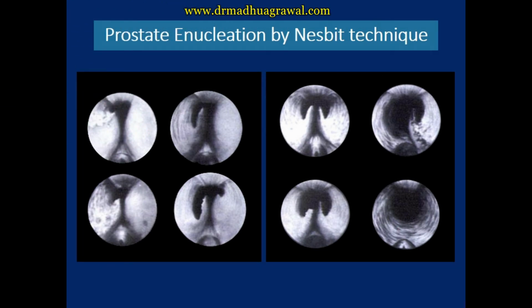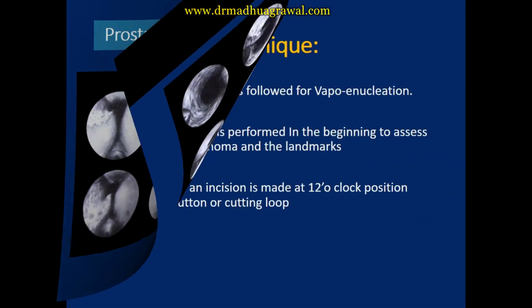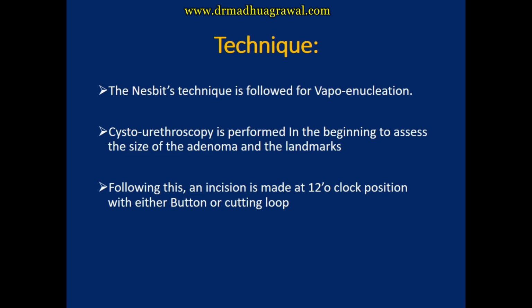This is the depiction of Nesbitt's technique of monopolar TURP. The Nesbitt's technique is followed for vapo-enucleation.